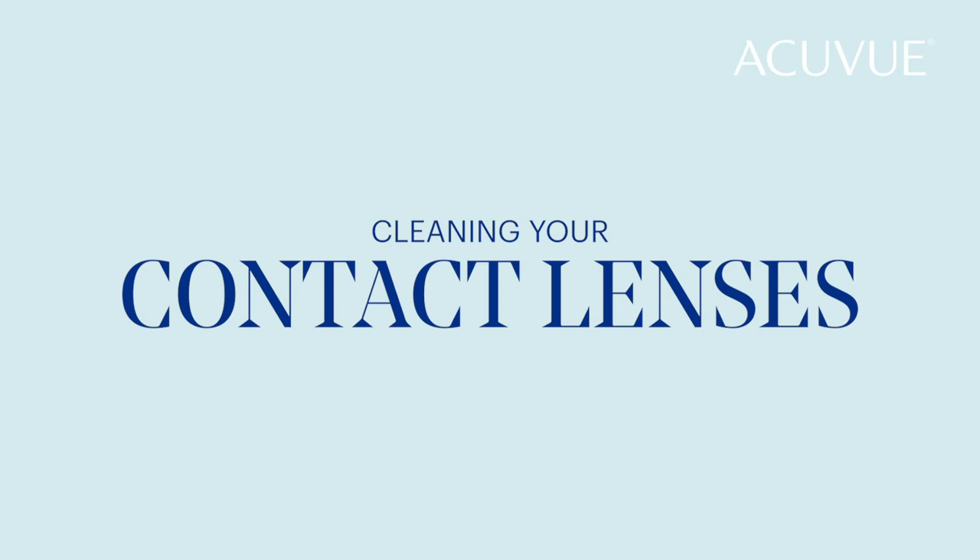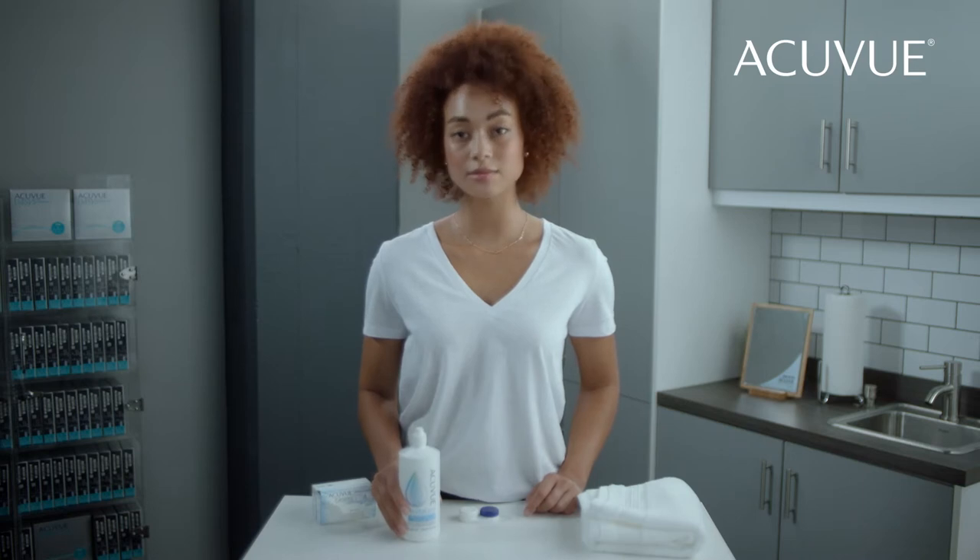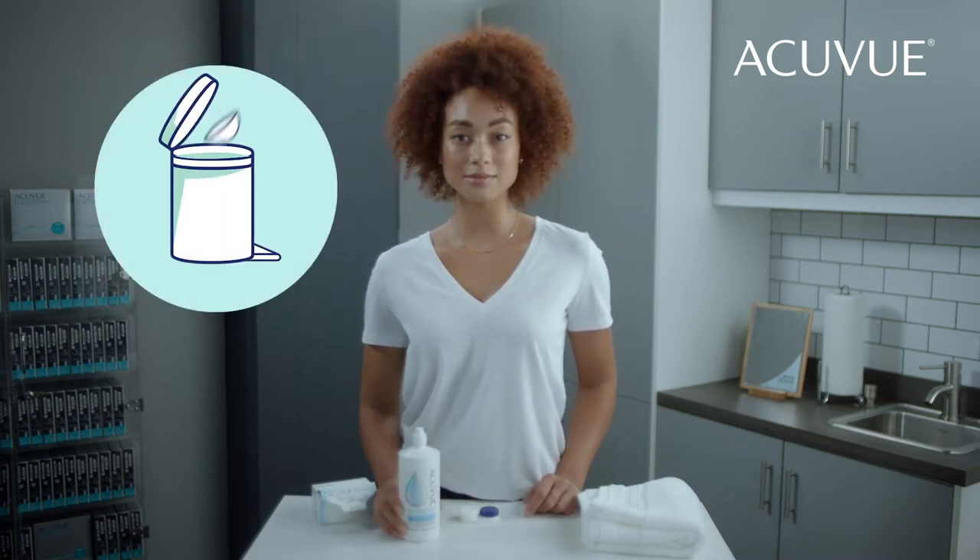Now that you've successfully removed your contact lenses, let's show you how to clean them. If you are prescribed daily disposable contact lenses, simply dispose of them at the end of each day.